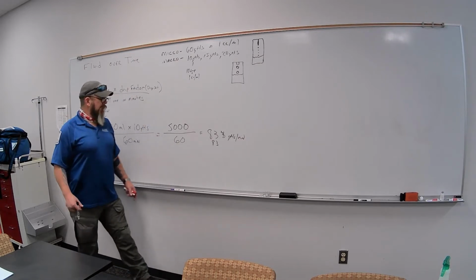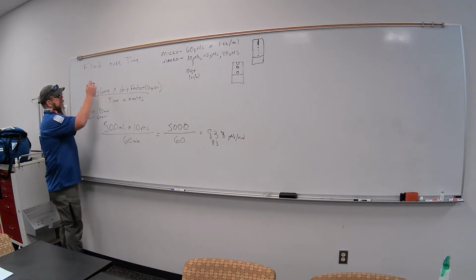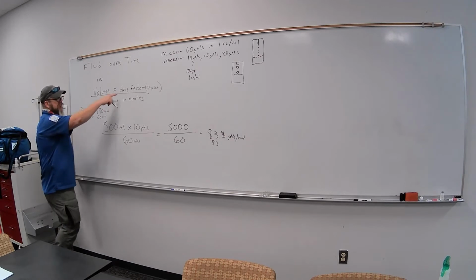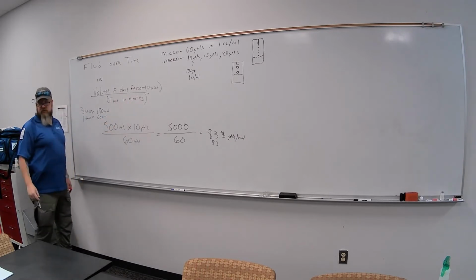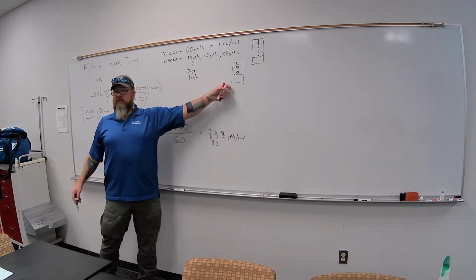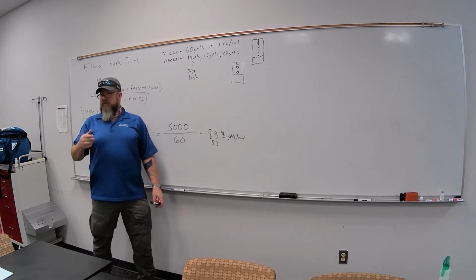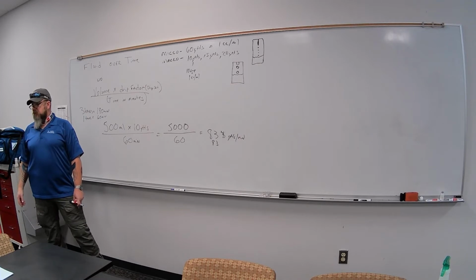Okay? So, the thing that we need to know, how much volume we're going to give, right? So you could call this dosage order, okay? Right? Times your drop factor, this is your drop set, and over what period of time we're going to give it in minutes. Okay? And then once you get that figured out, then you just got to watch the chamber and adjust the flow rate, right? Till you get where you want to be. Okay?